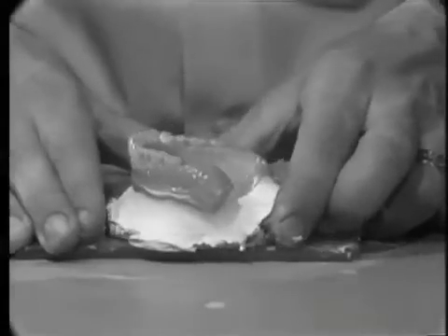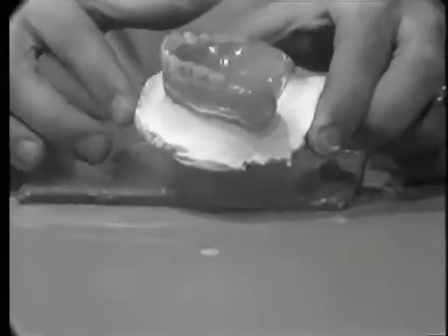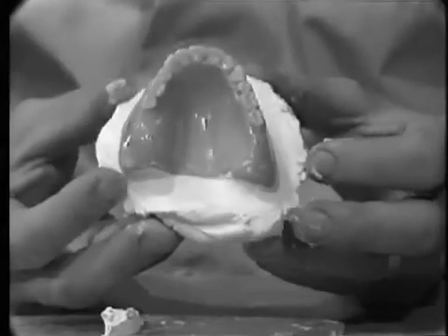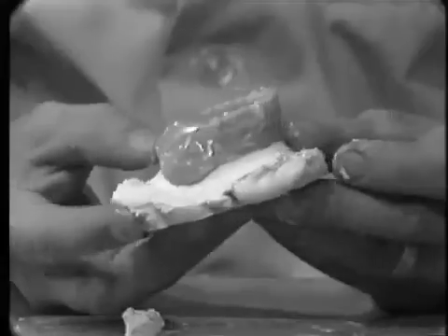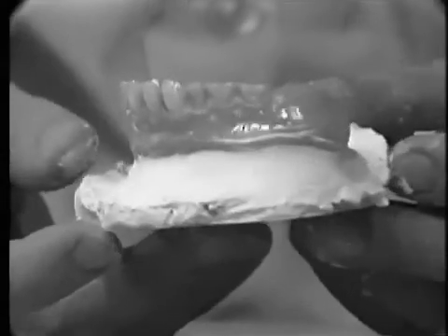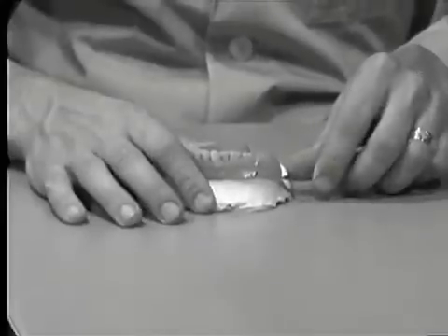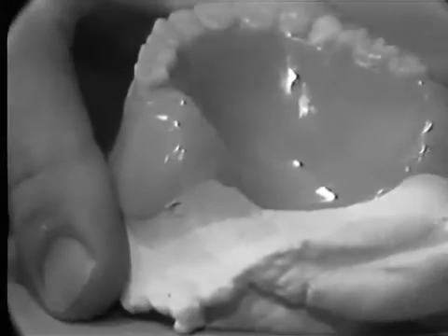After the plaster has completely set, the casts are removed from the glass slab and the borders are inspected. We should be able to see all the peripheries of the denture above the plaster. Using either a buffalo knife or a number 7 wax spatula, the denture is carefully removed from the cast. It should be teased in several areas so as not to break the remount cast.